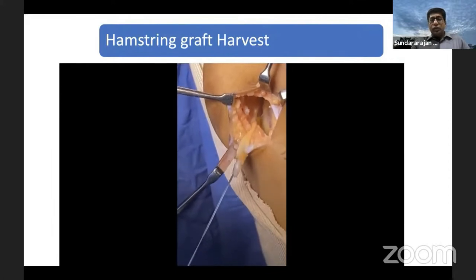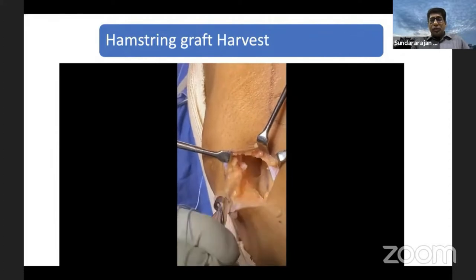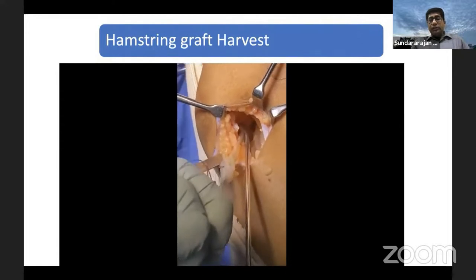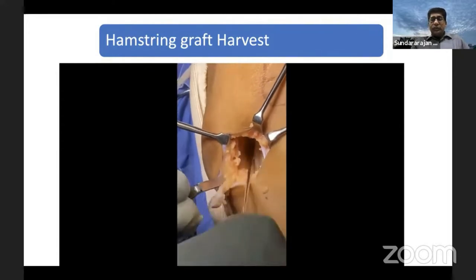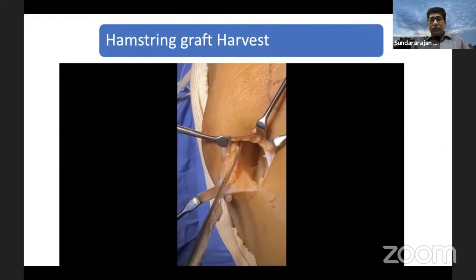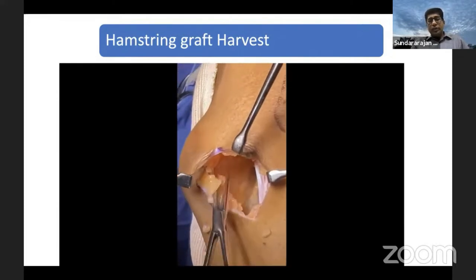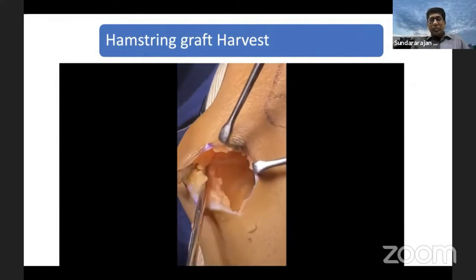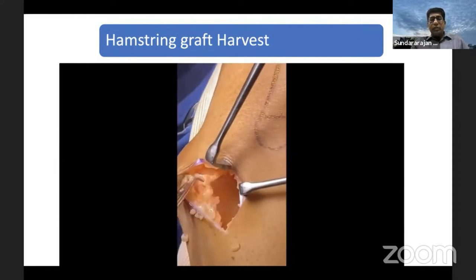Then you make loop stitches over the semitendinosus. Then use your tendon stripper. You can go around the semitendinosus, go deep, with a slow pushing motion and it will just cut off the muscles and come off. That is your semitendinosus. Once you have taken off the semitendinosus, many people use five or six strands because we want at least 8mm or 9mm graft in most situations. Sometimes you may not get enough length and thickness from semitendinosus alone.